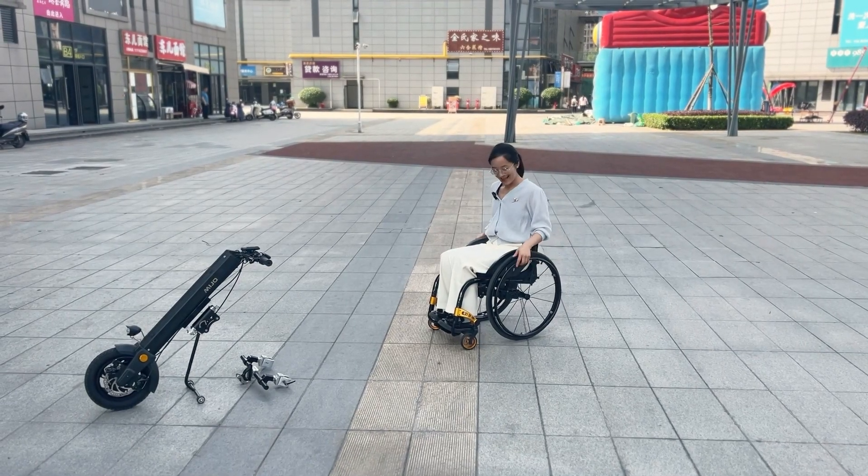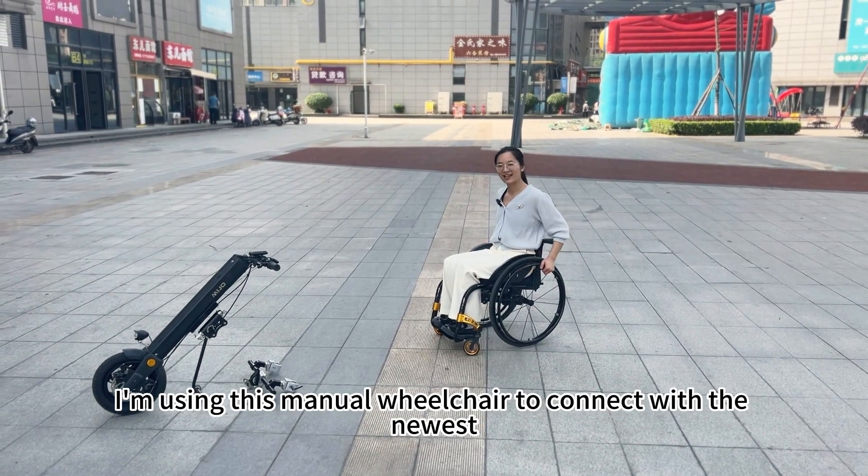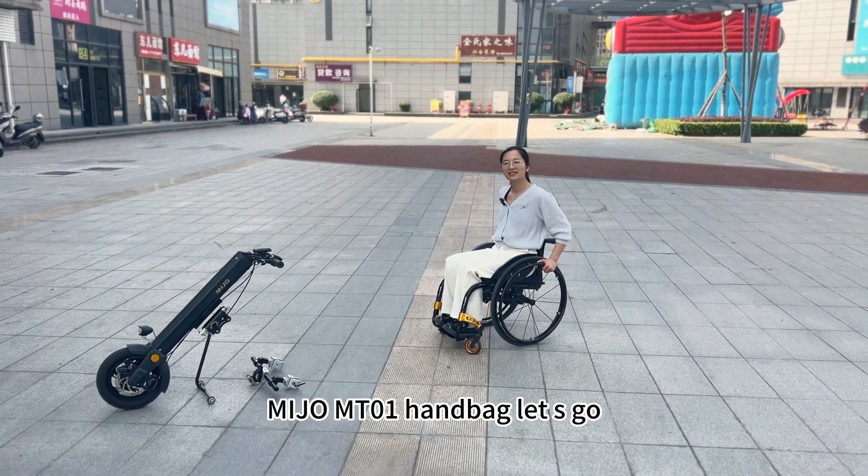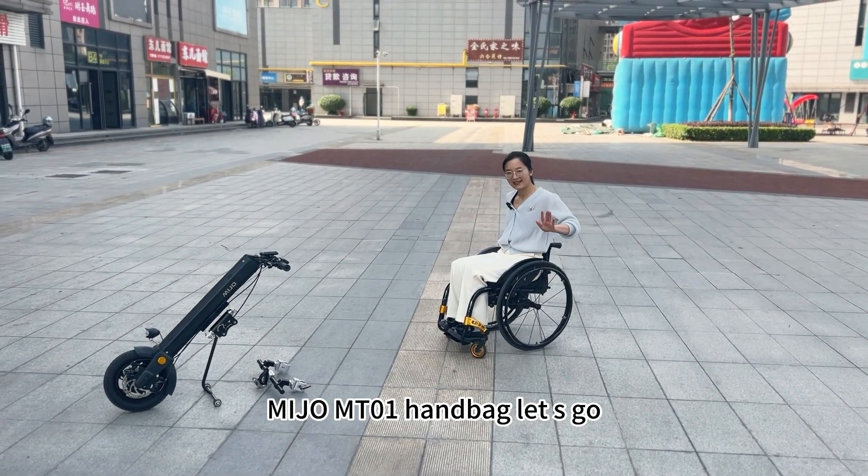Hello! I'm using this manual wheelchair to connect with the newest MIJO MT01 handbike. Let's go!